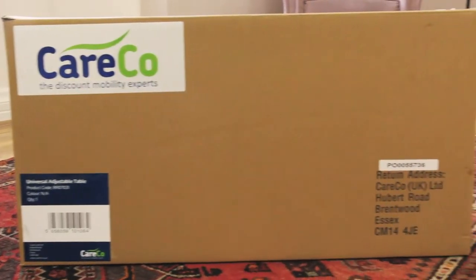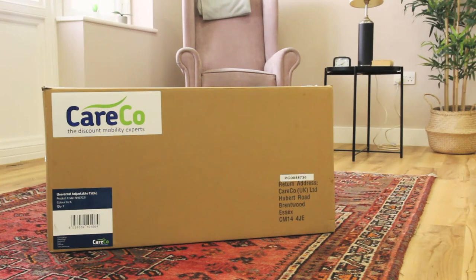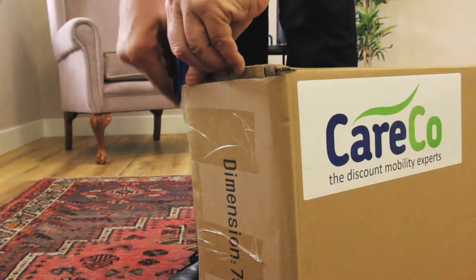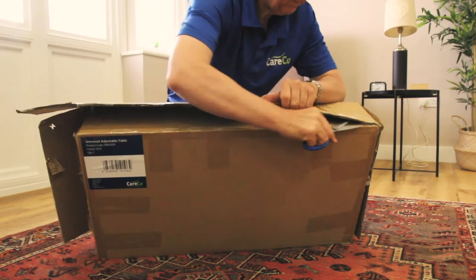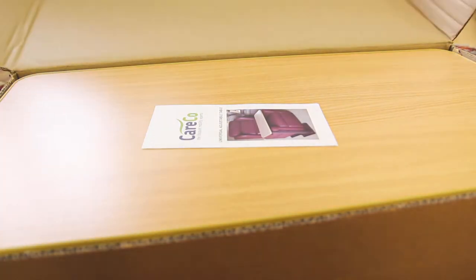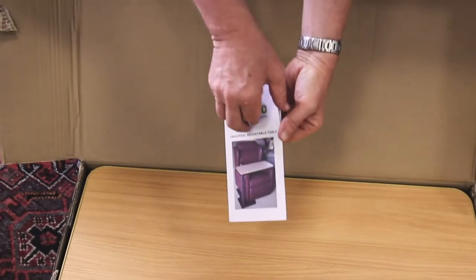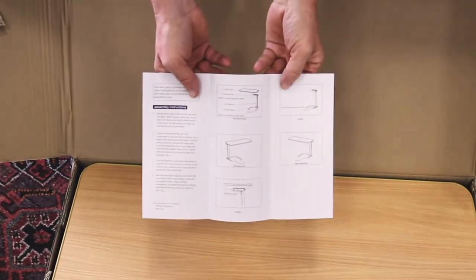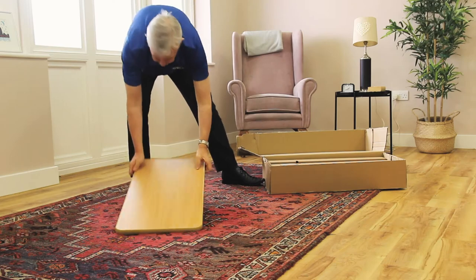Your universal adjustable table should come fully boxed as seen here. Courier delivery straight to your doorstep is available from Careco. Carefully cut the tape with a knife or a pair of scissors to open the box. Once open, you'll find printed instructions. Please keep hold of these for reference when assembling the product or should any other issues arise.